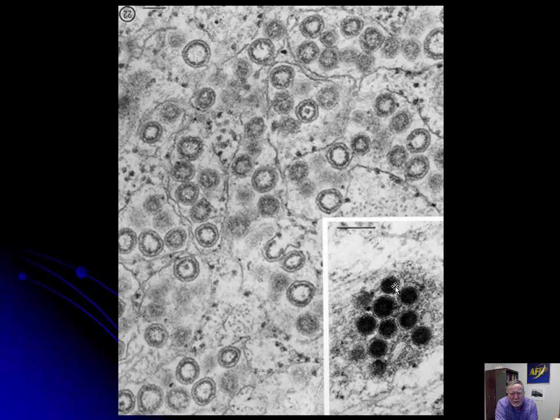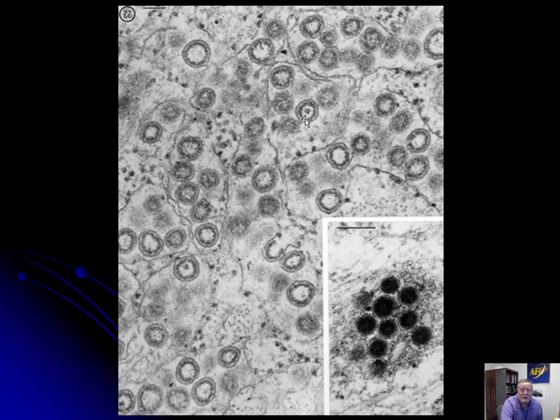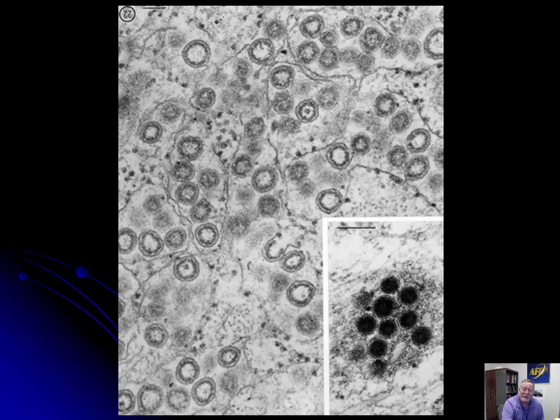When we look at coronaviruses on EM replicating within lysosomes and ER — just as we saw with the toga viruses — you can't see the peplomeres. So it's useful to know that's something you won't see in most preparations. Ultrastructural pathology is not something you want to do blinded. You need information about the species, sometimes the organ system, and a history of the particular disease before making specific diagnoses.